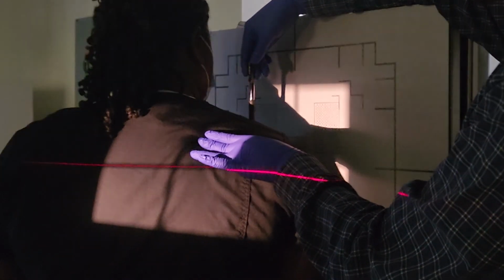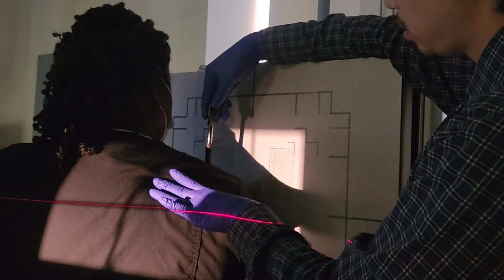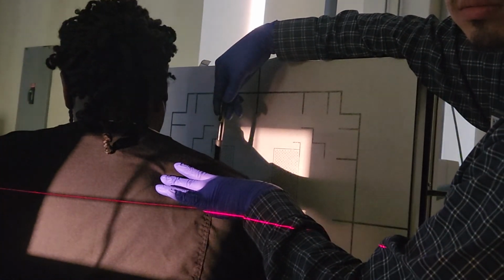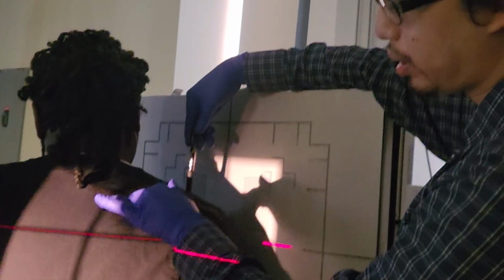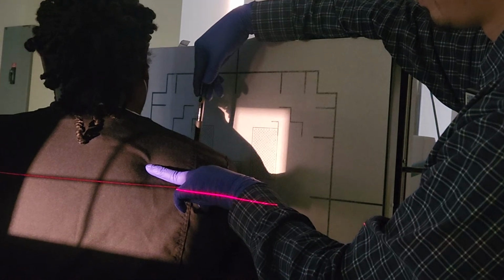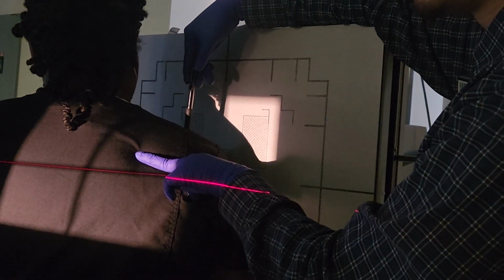So what do I need to do with my patient? Well, what if I just slide my patient? So slide back, Shamika. You hit the light, please. Now is the AC joint on the central ray? Yes. Is my superior angle on the central ray? No, central ray's over here, right? So how do I get these two to both be on top of the central ray? I should need to step closer on the other side.